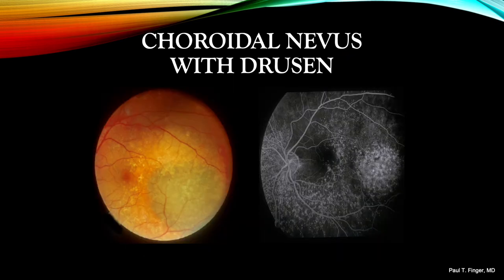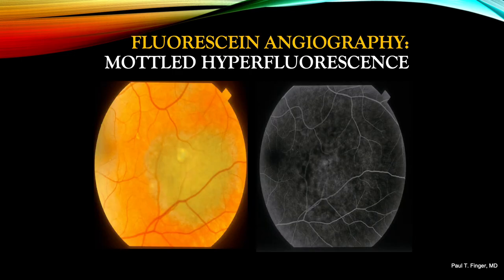Hard drusen are not considered to suggest malignancy. They are often seen on a tumor's surface, but also, as in this case, on the surrounding retina. Hard drusen are considered to be a byproduct of retinal metabolism. Fluorescein angiography of a choroidal nevus is likely to show a pattern of mottled hyperfluorescence. This pattern suggests that the nevus is causing a disturbance of the overlying retinal pigment epithelium, changing its ability to block fluorescence. Consider that choroidal nevi can be located in different positions within the choroid, thus affecting the amount and change of overlying tissues.